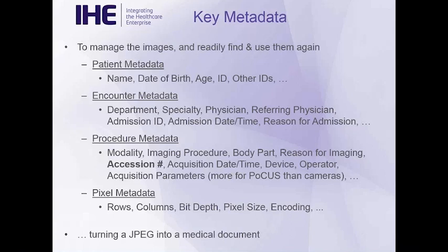So we've grouped the metadata into 4 categories. There's the patient metadata, which is all the typical identifiers and demographics that you'd expect, you know, name, date of birth, age, etc. This is how it gets woven into the medical record.